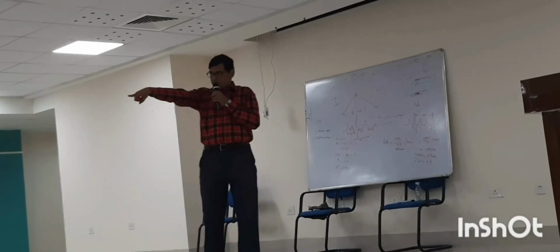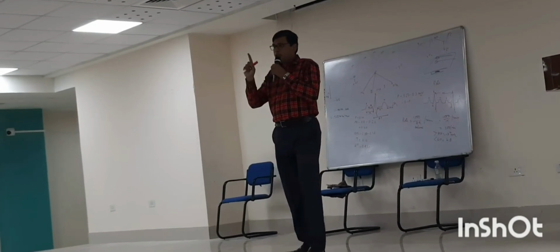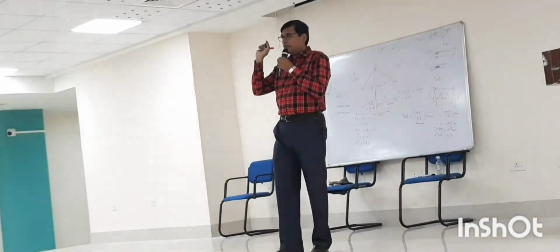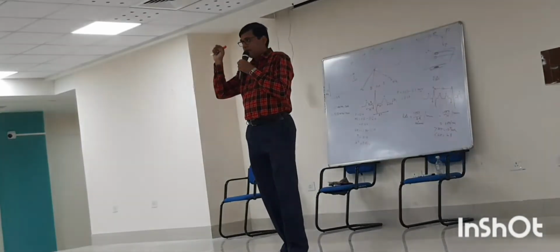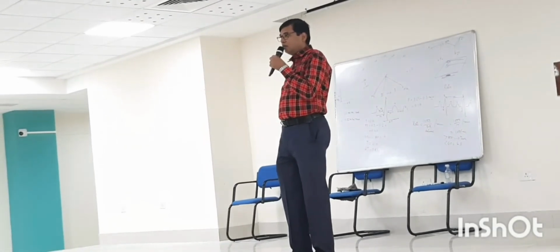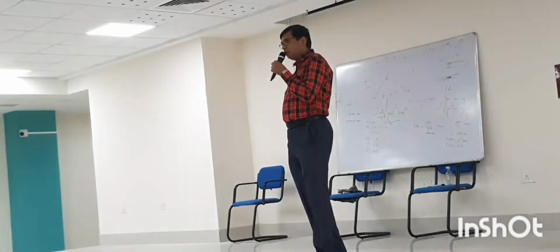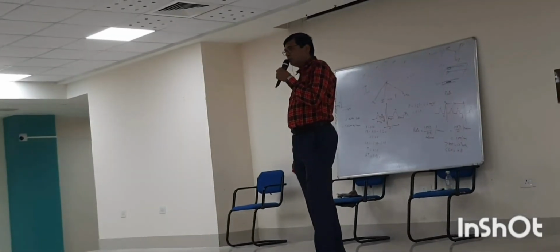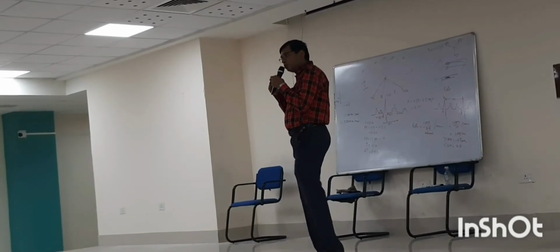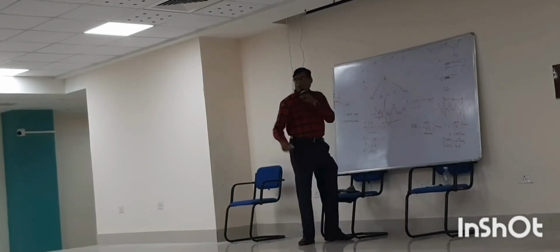Consider lead 1. So what is the QRS difference? Positive deflection minus negative deflection. How many small squares are there? 5. And 3. 5 minus 3 is equal to 2. I am placing the point here. Then AVF.